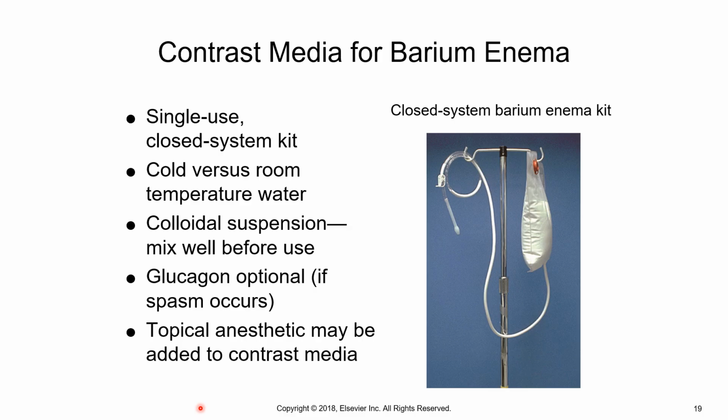So I would argue that you would want to use room temperature, as close to body temp as you could get, because then the body is not shocked. If it's too hot, then you can burn the patient. If it's too cold, it definitely can lead to spasm.